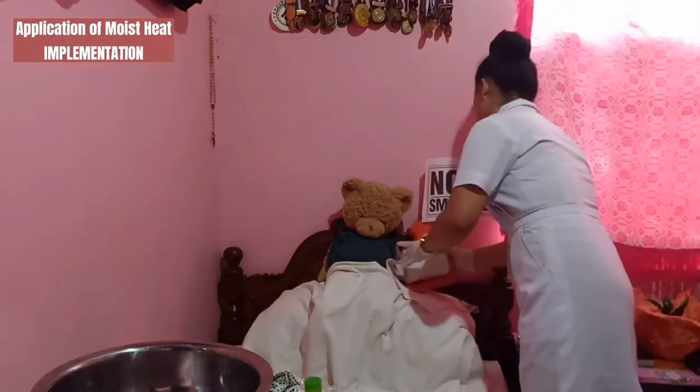And then you can apply aquathermia, heat pack, or waterproof heating pad over the towel, and then keep it in place for the desired duration. And you can change the warm compress using sterile technique as ordered if the pad or the heat pack was not used. Then you can apply clean gloves again. And then now you can remove the pad, the towel, and the compress.